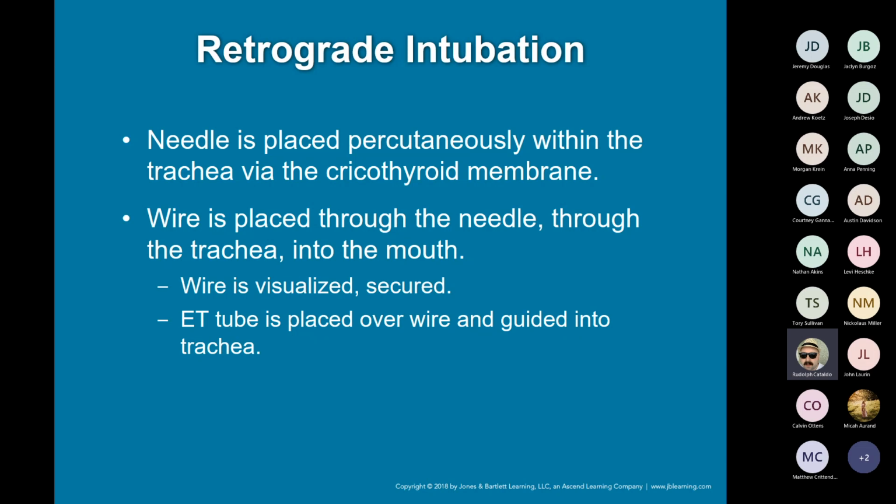You're going to hear about this more commonly in severe cases of trauma, where maybe they can't identify anatomical landmarks for intubation. Again, in the state of Iowa, we're not allowed to use anything to create an opening that has a sharp edge, such as a scalpel. We can use a needle, or what they call percutaneous, but we can't use a scalpel or any sort of knife to create an opening. That's why we have quick trachs. That's why we have needle crikes.